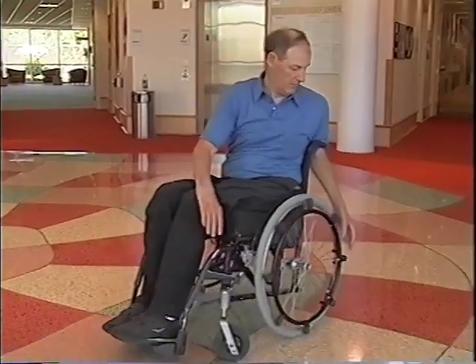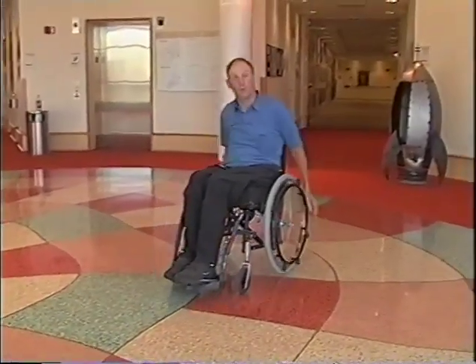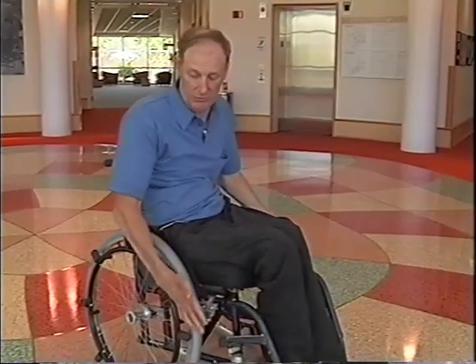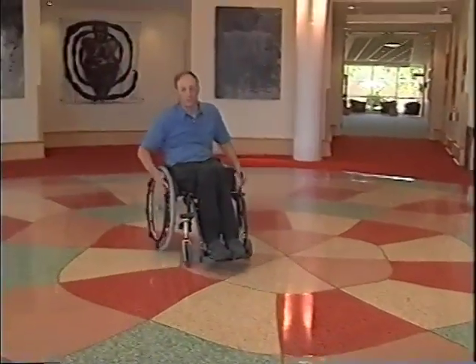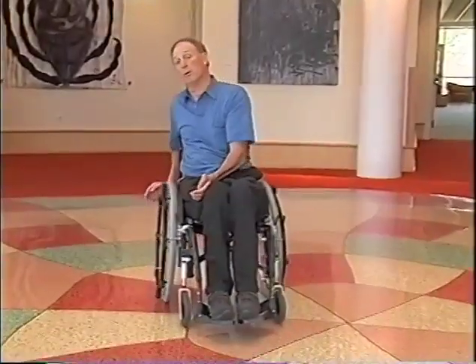Another way that I used to back up, especially off of elevators, was to back up this way, putting your hands behind you and straightening your shoulders out. Either way will work fine. Just find something that's comfortable for you. Certainly pulling backwards is a matter of getting your hands locked in there, or your wrist, and pulling backwards. And the other method can be especially good if you're backing out of an elevator or something like that, where you need to be looking where you're going.